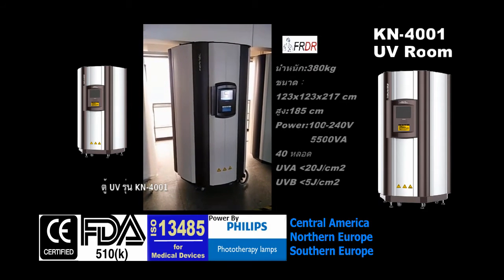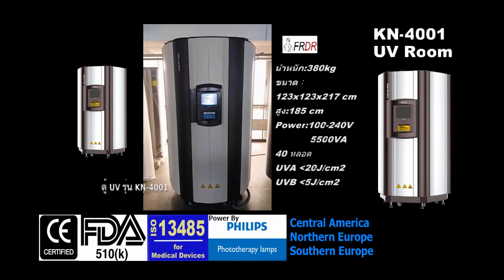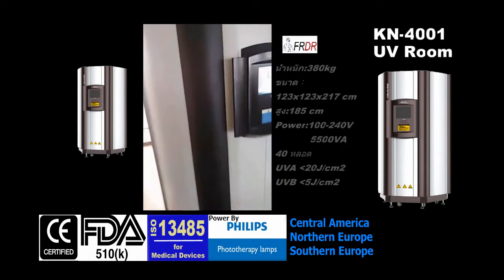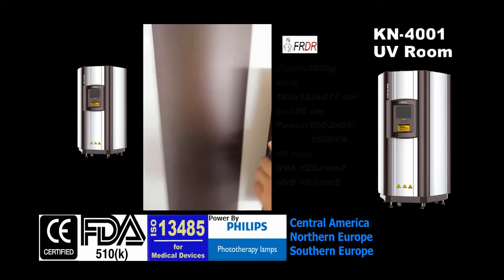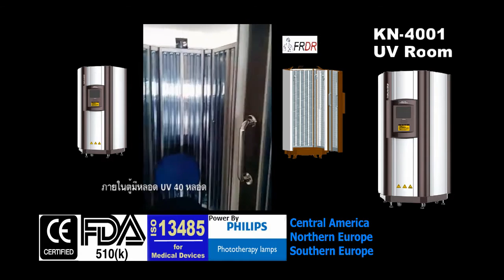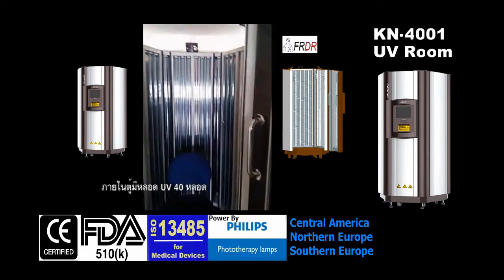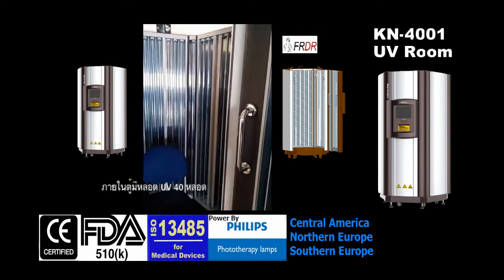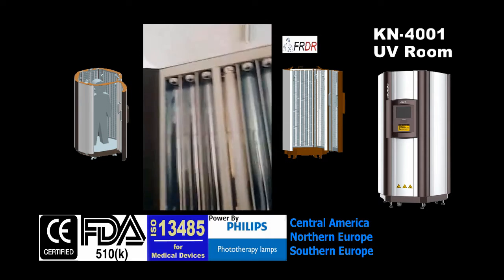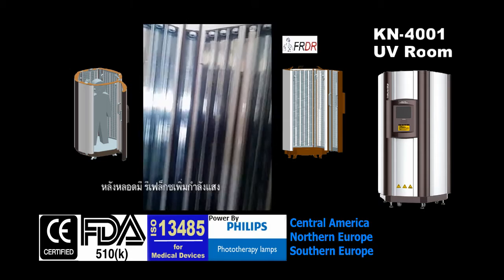Hello John, this is our whole body chamber, model number KN4001 — a whole body UV chamber for surface treatment. This whole body chamber is equipped with 40 UV lamps, either UVA or UVB. For this demonstration, I only equipped four units of lamps.